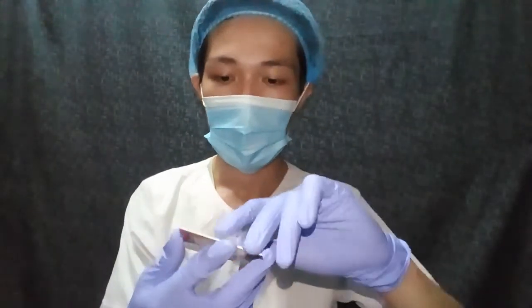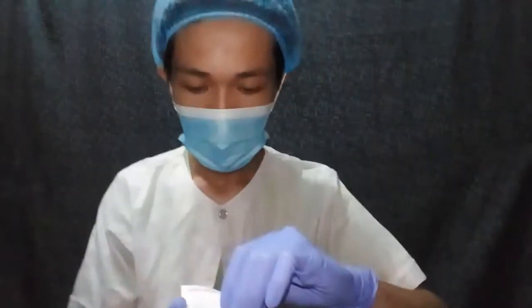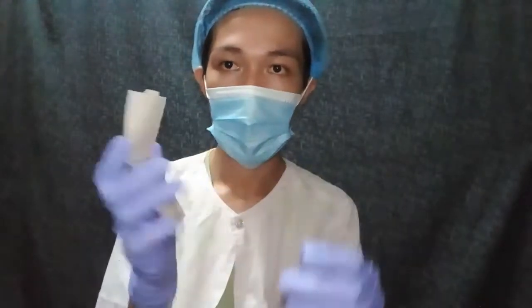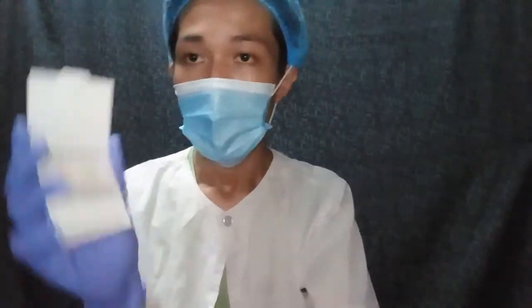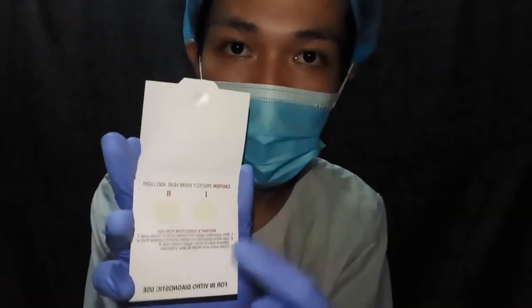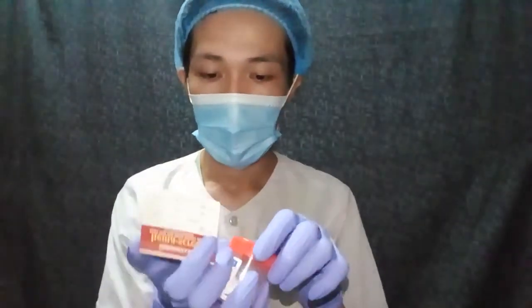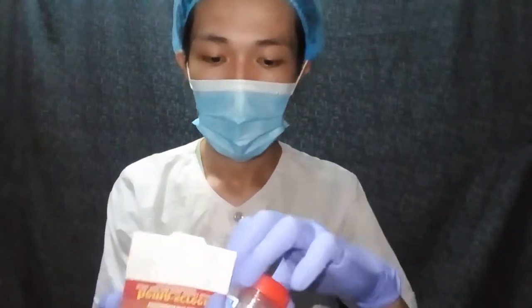Now we are going to proceed to the actual laboratory exercise. First, obtain the hema screen and open it. Here I have already opened it. As you can see, there is oval one and oval two. Get your specimen container and put some sample on oval one.